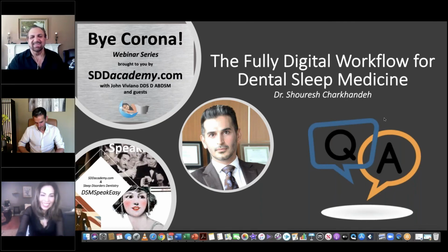I try. Okay, so here we go. You can take even an orthopantomogram to see the TMJ at lesser radiation. And to control better the vertical dimension, look to the place of the wisdom teeth to interfere. The vertical dimension is a minor factor to fail the oral appliance therapy.